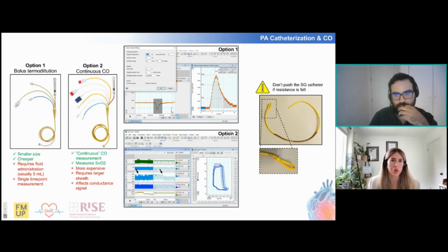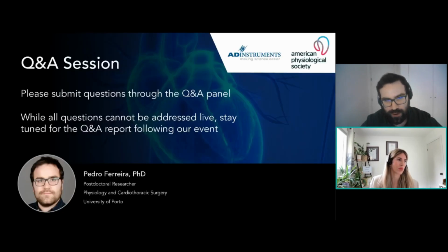We have kind of a two-part question. Somebody asked, what's the difference between a ventricath and a microcath? The ventricath is the pressure volume catheter, and the microcath is just a high fidelity pressure catheter. These are very small 3.5 French tip catheters that you can use to record pressure that Millar sells. Both those catheters can connect to the MPVS Ultra, and that's what I meant in the slide where you could connect those.